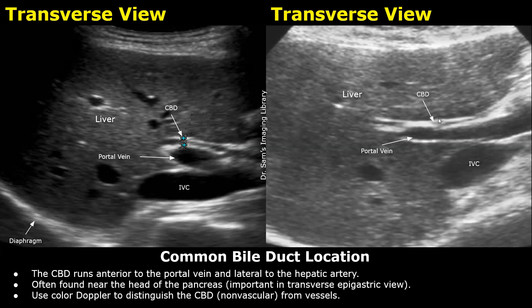Because vascular structures such as the portal vein and hepatic artery lie in close proximity and can appear similar on grayscale imaging, color Doppler is essential to differentiate the CBD, which shows no color flow, from adjacent vascular structures that demonstrate flow. You will not see any color Doppler signals in the common bile duct.